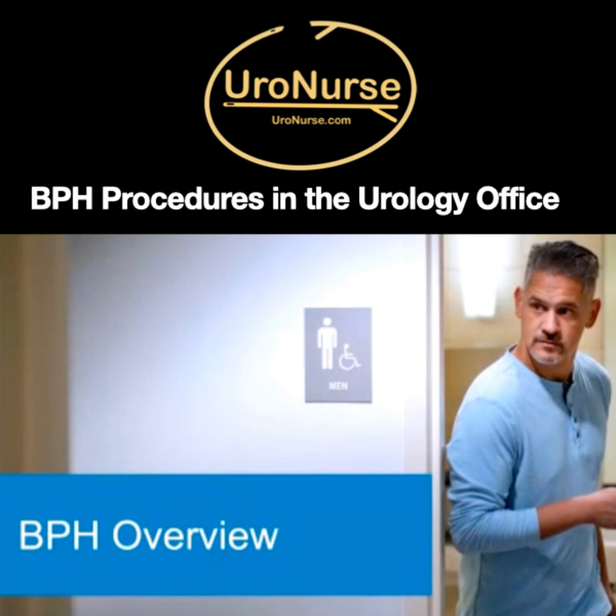One of the major reasons I don't do Rezum is that I'm very empathetic to the folks, such as my nurses and medical assistants. I don't want you to keep getting those irritative voiding symptom phone calls. Even though you can inform the patients beforehand and educate them, they're still going to call you. And guys, as you all know, hate the catheter. So Rezum, you're guaranteed to have a catheter, whereas with Urolift, most of my patients do not need a Foley catheter. And that's one of the major reasons I don't do Rezum. It's the irritative voiding symptoms and the need for occasionally prolonged catheterization.